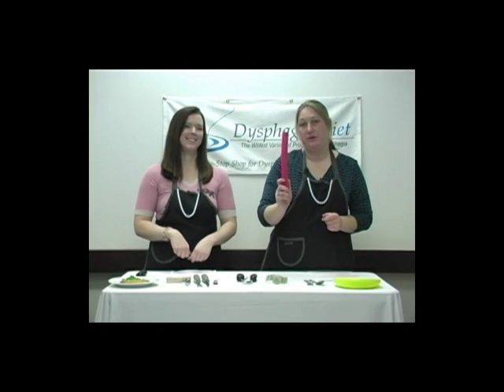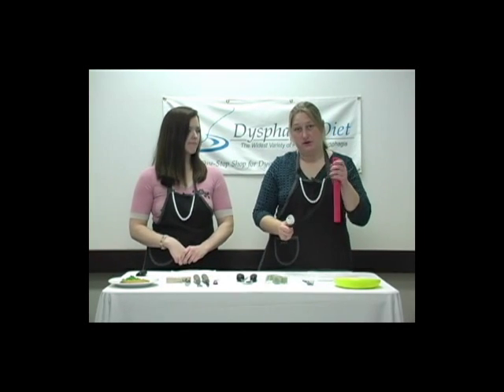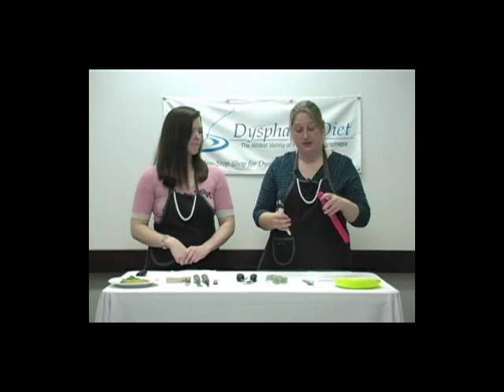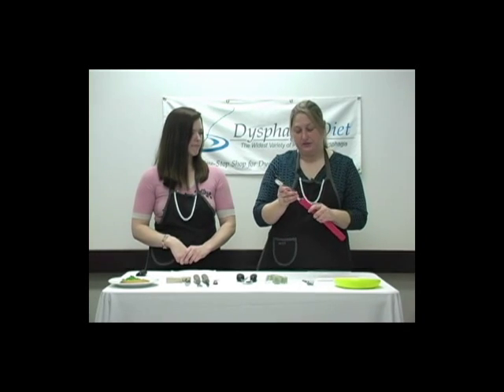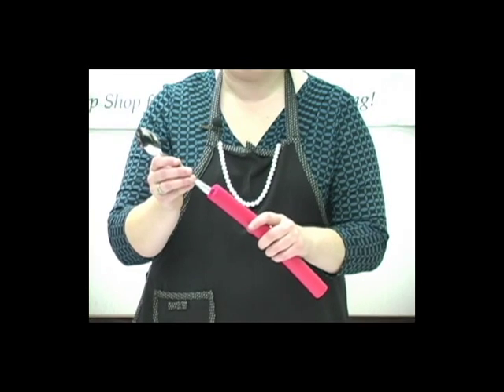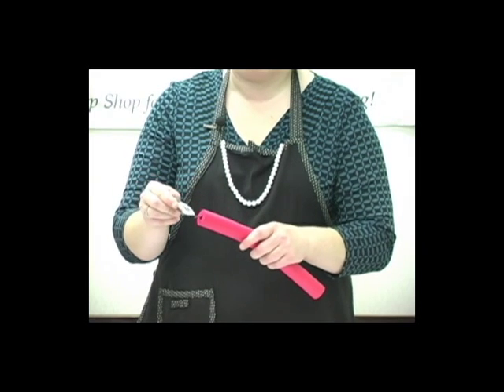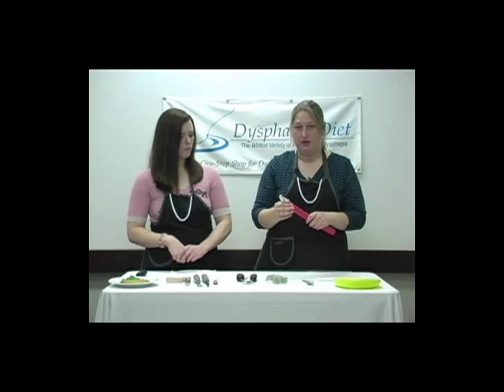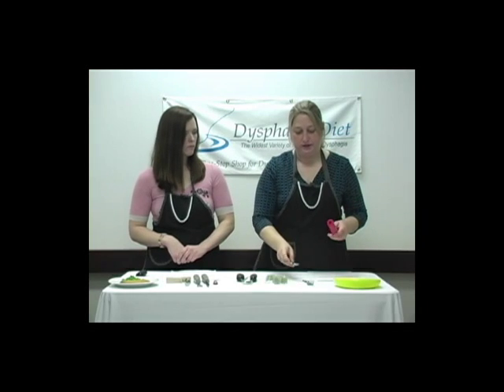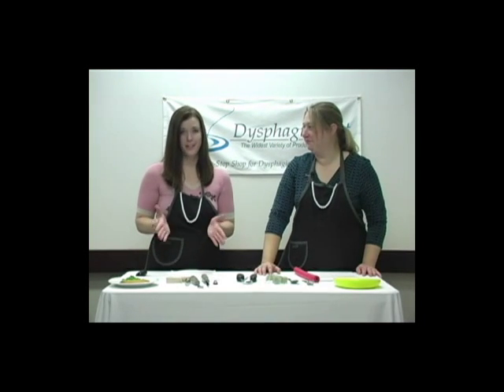First I want to show you is this red tubing. It's really great if you need to build up a handle for someone that can't grip things very tightly. All you do is you take your utensil or razor or brush or anything else that will fit in here, scoot it in the red tubing like this, and cut to size. Then when you're done, all you have to do is pop that out, wash it, and you're good to go for the next use.